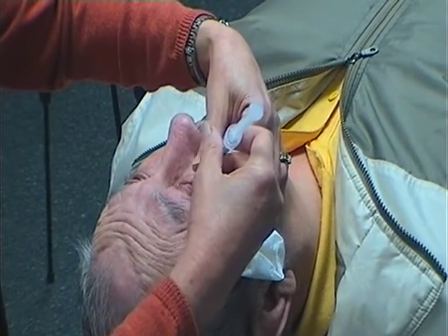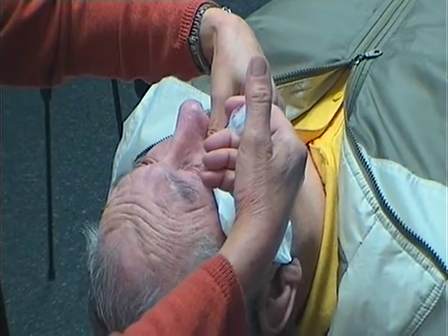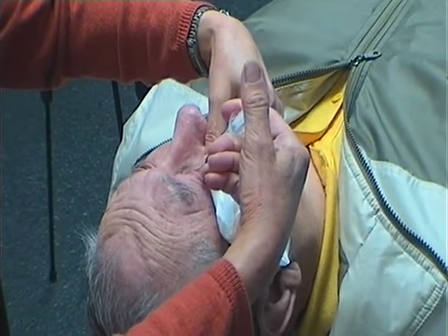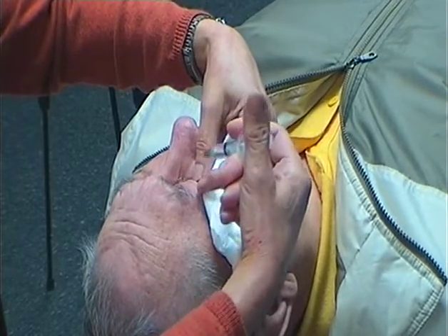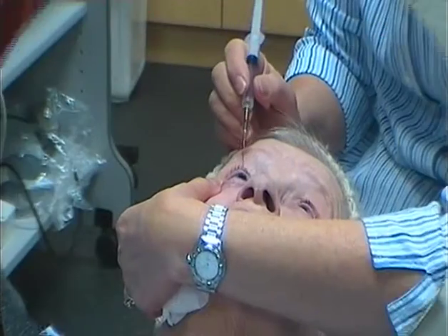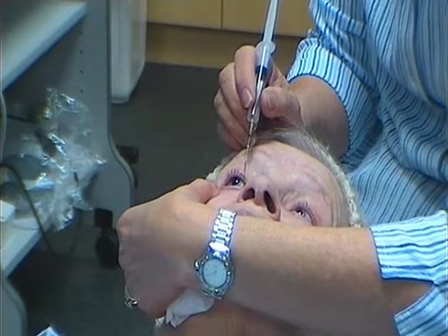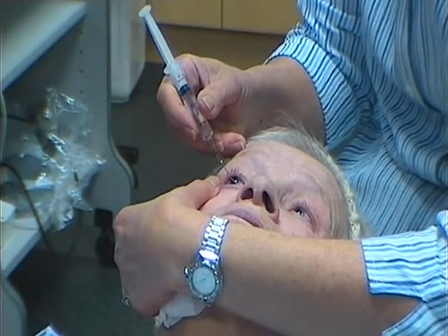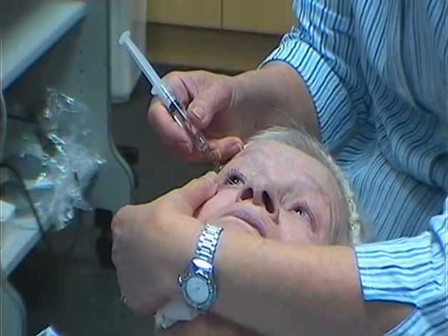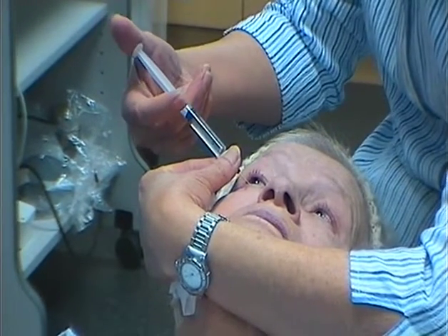I've always found the technique flawed, and these clips show why. Once the cannula is positioned within the tear duct, it is then necessary to re-grasp the syringe in order to inject the saline. In so doing, the cannula can become misaligned or can accidentally be completely removed from the tear duct.